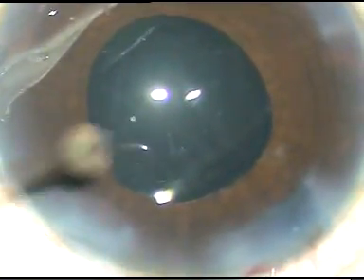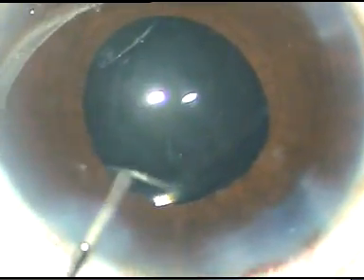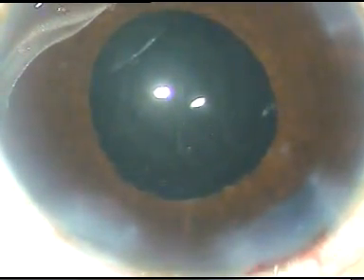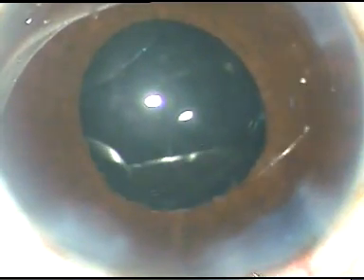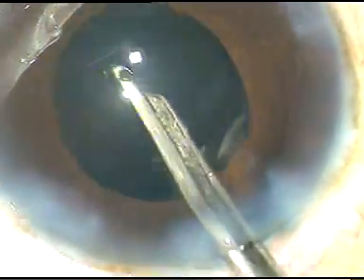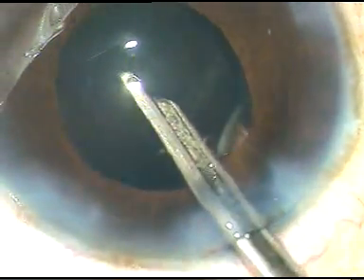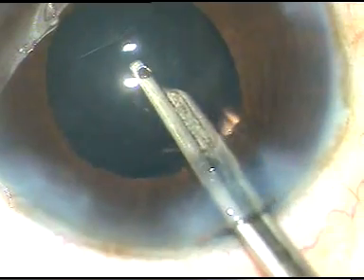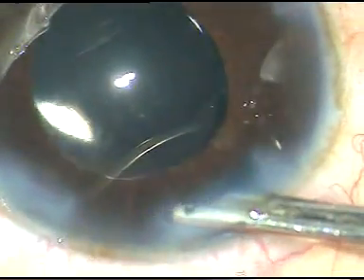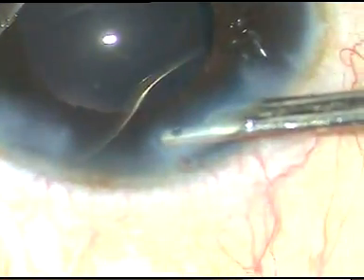Now, a little bit of moxifloxacin is injected into the anterior chamber. The side ports are hydrated to make the ports waterproof. And the final wash is given. The anterior chamber is formed, and the case is concluded. Thank you very much for your attention.